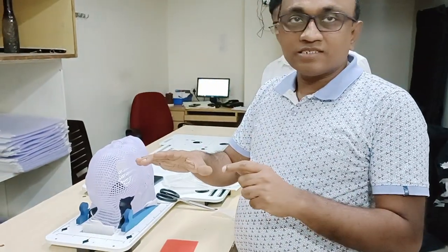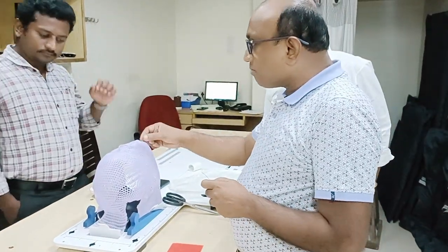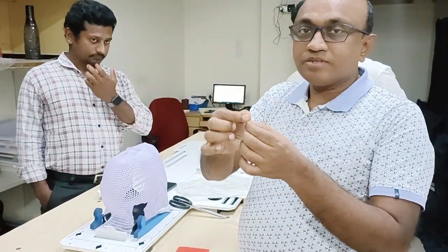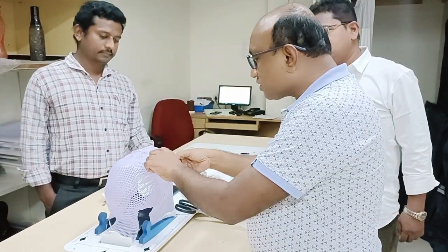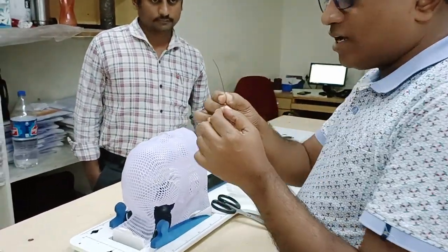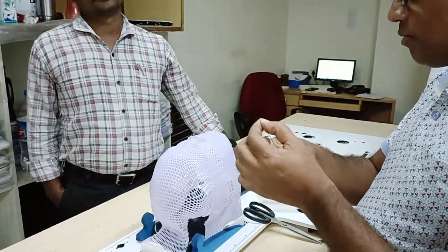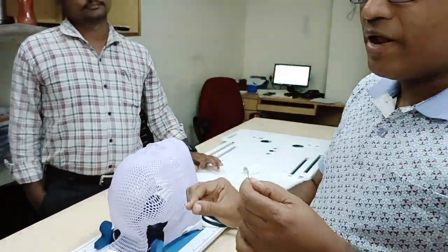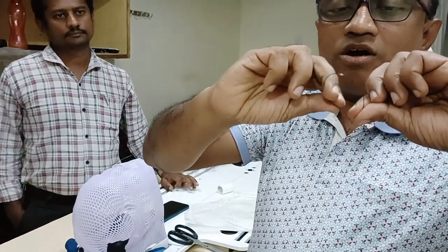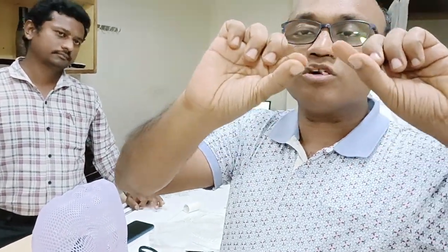Make a mask of the person and put a thin copper wire on the scar — if it is a post-op case, place a small copper wire as a scar marker. If there is a primary tumor, you can put the copper wire around the boundary in a circle or according to the shape of the tumor.